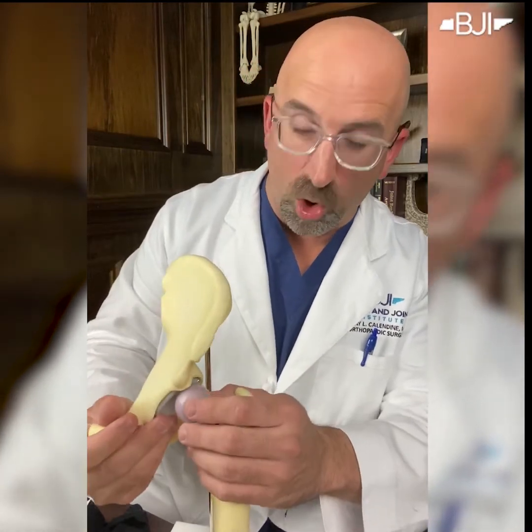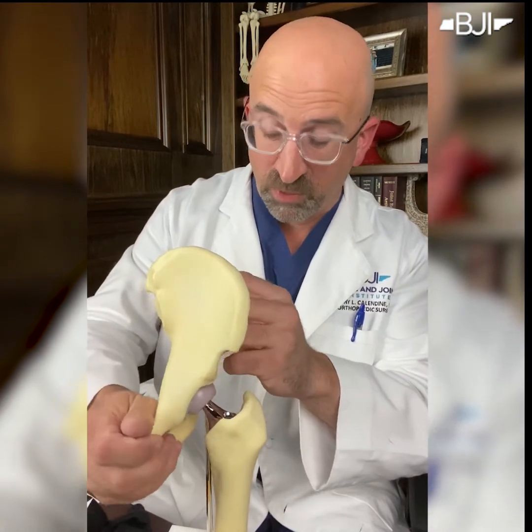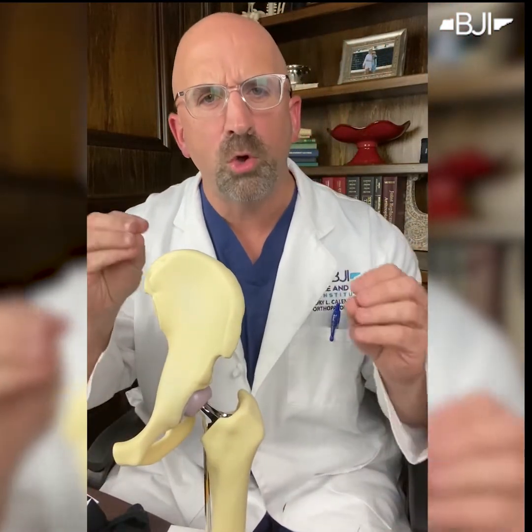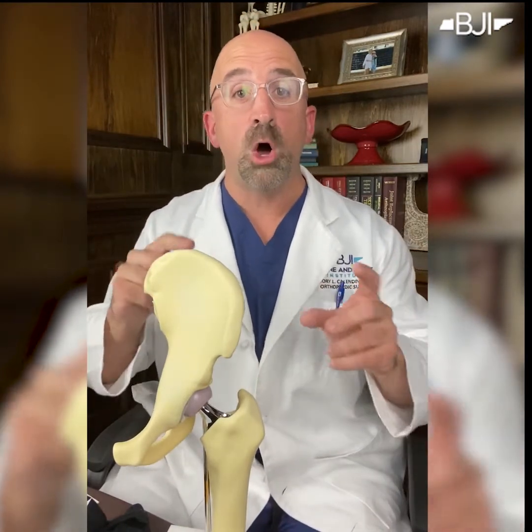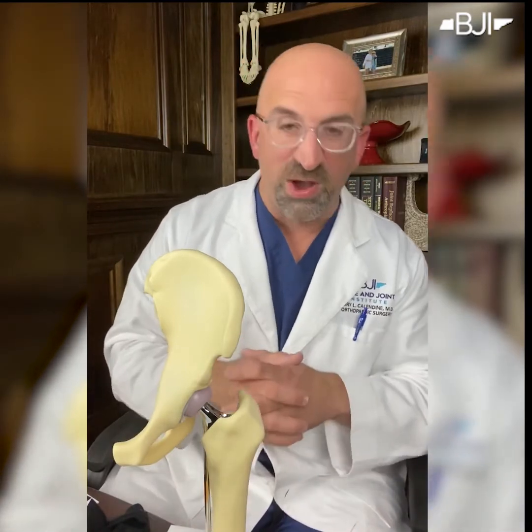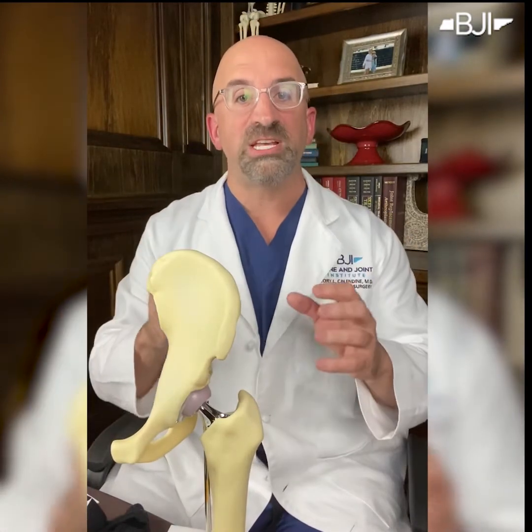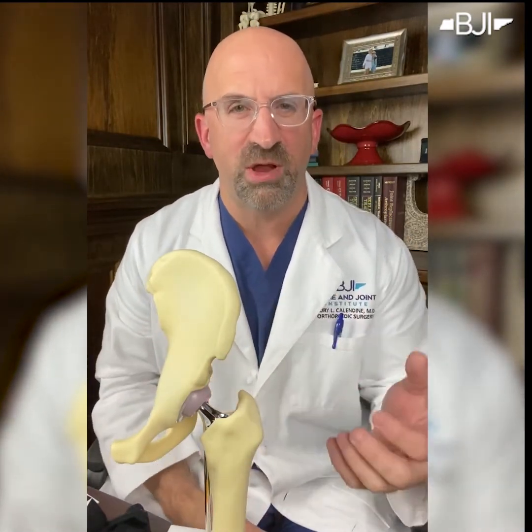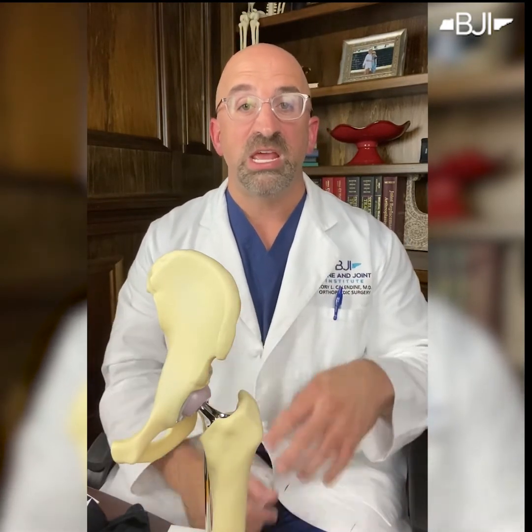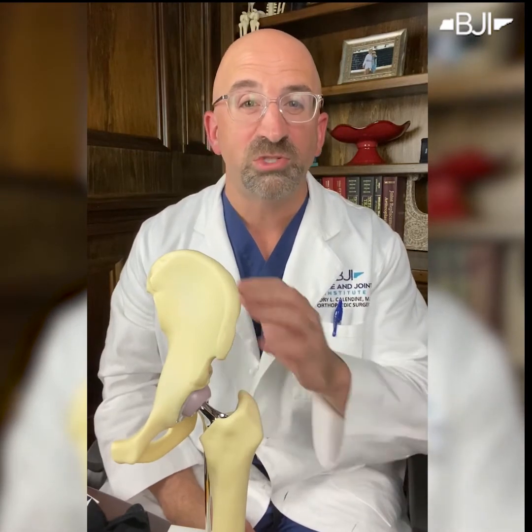Once we're done, we put them all back together. The problem in hip replacement is we're solving bone on bone — so instead of bone on bone, there is metal and plastic in between. Everybody wants to know how the parts are held together. Well, they're not really. The hip replacement is kept in place by the muscles around the hip. That's why physical therapy is so very important. So hip replacement is four components, four parts, and we rebuild both sides of the joint.